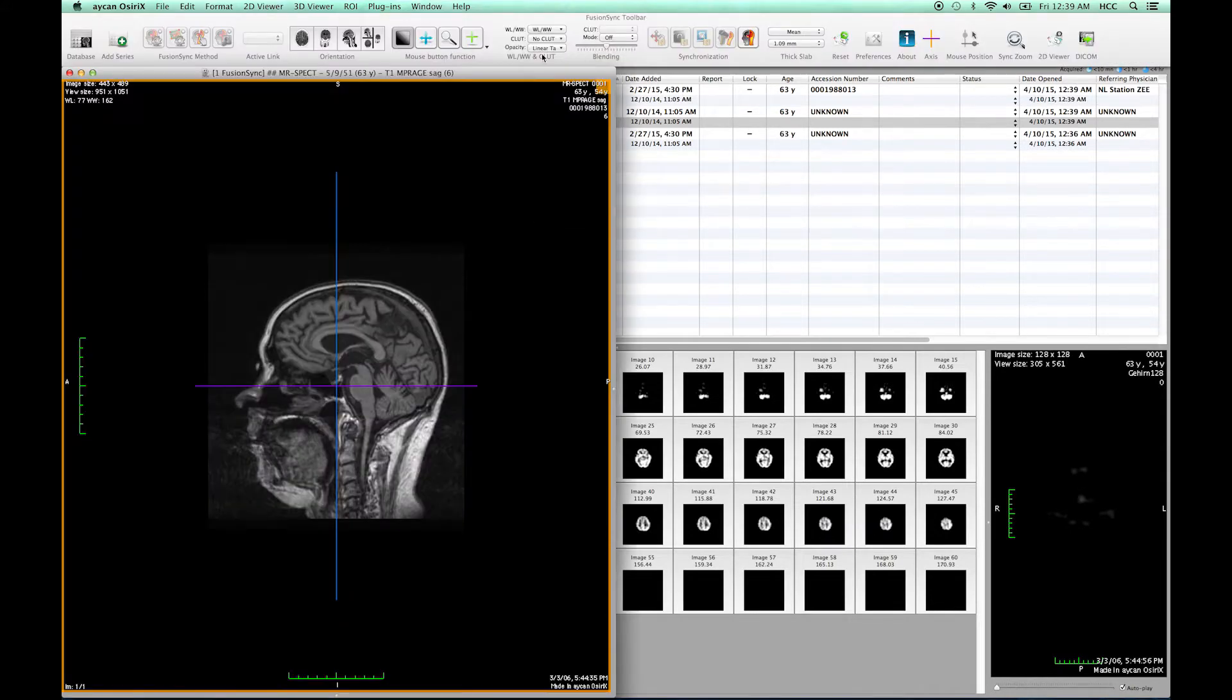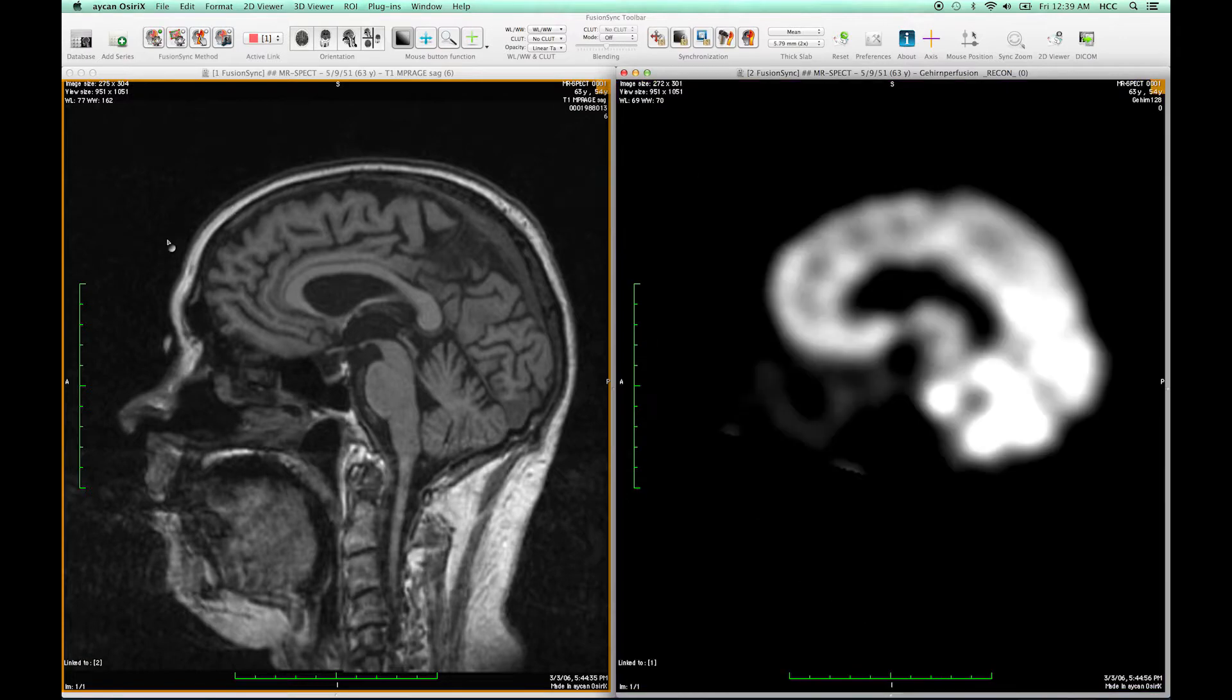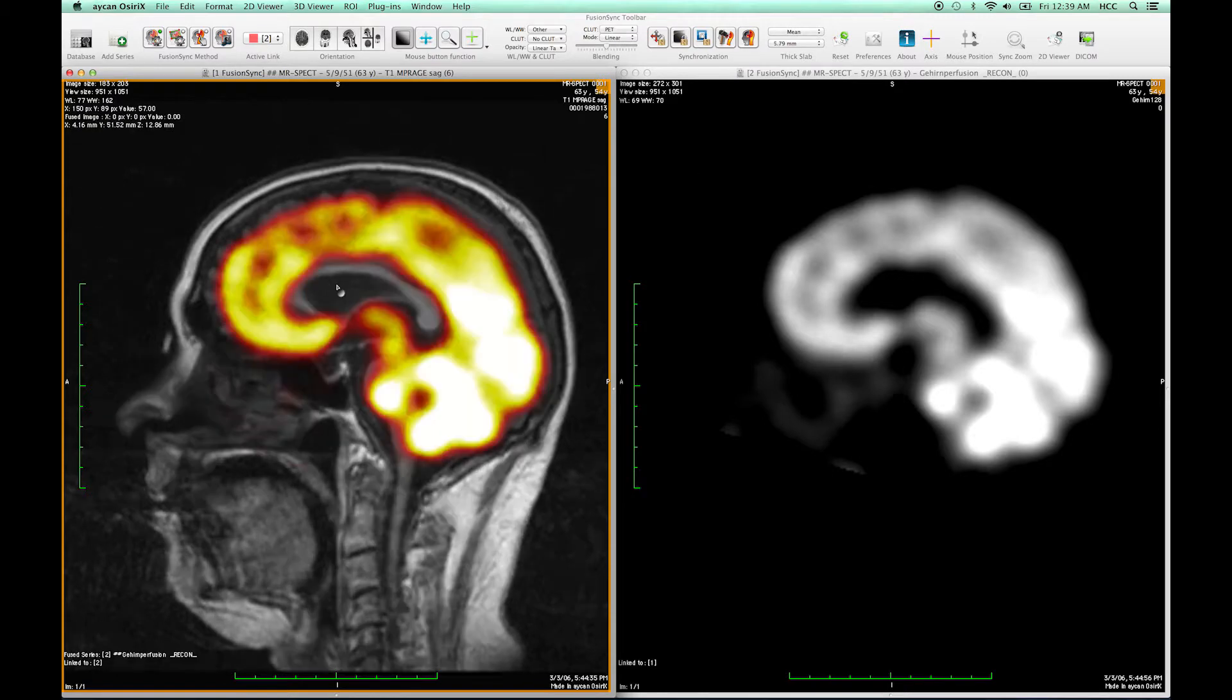FusionSync applies the automatic registration between the SPECT and the MR and we can use for example an overlay visualization between the both for comparison.